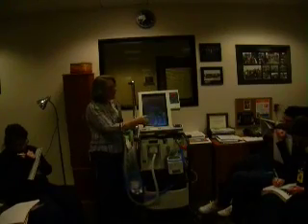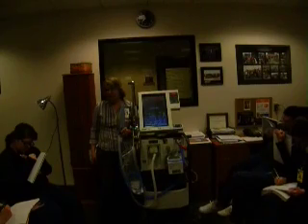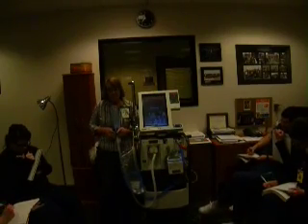Okay? So minute ventilation is going to be set 2.0 above and 2.0 below where your patient is averaging. That is a class value that will vary widely in the clinical setting, which I'll explain more later.